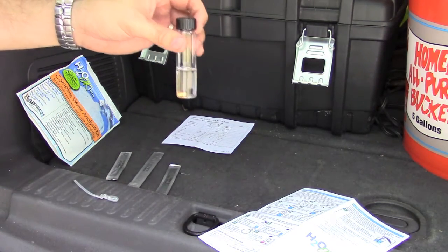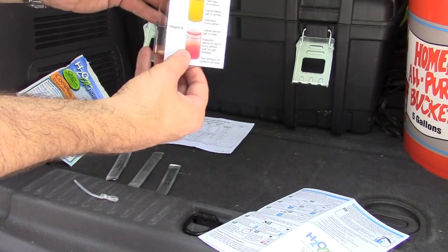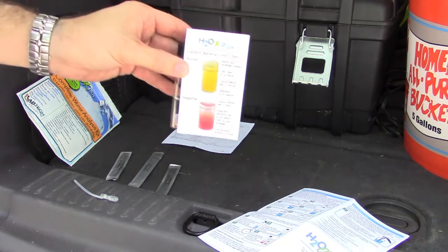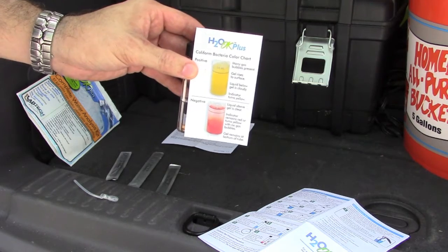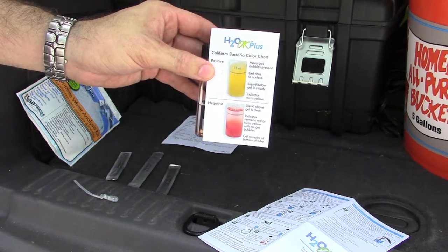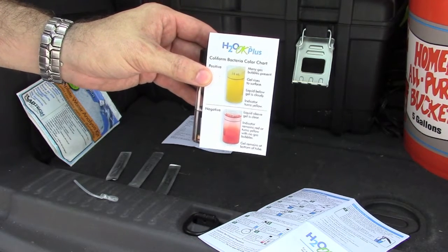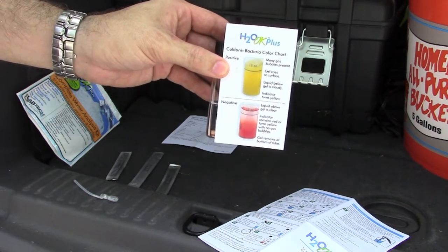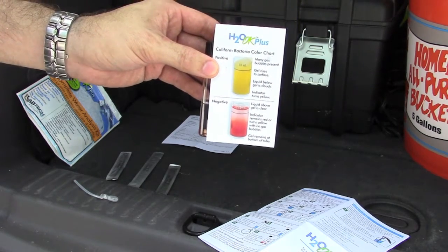That obviously isn't going to happen on camera right now. After the 48 hours we'll compare to the chart to get a positive or negative result — to determine if I can drink that water straight out of the well. Hopefully I can without treatment. Someday when I connect it to the house I will treat it, but for now there's really no need unless I need a drink in the field. For now, I'm just using it for garden irrigation.